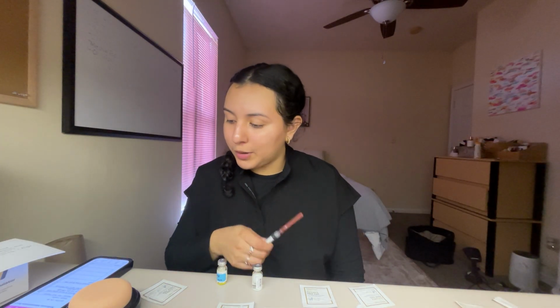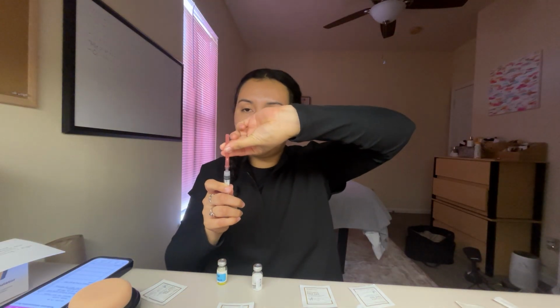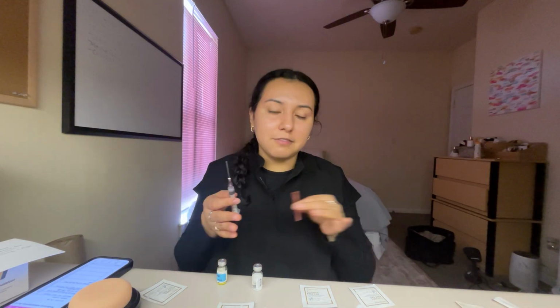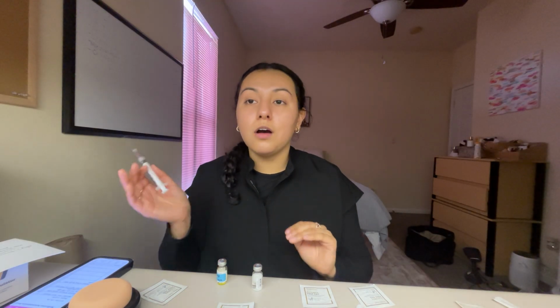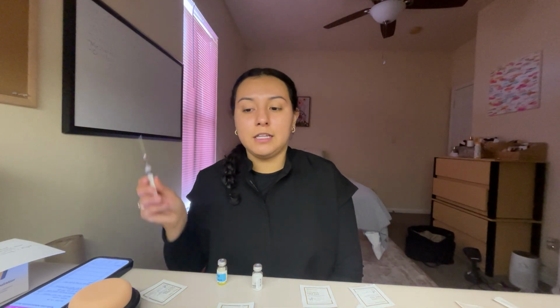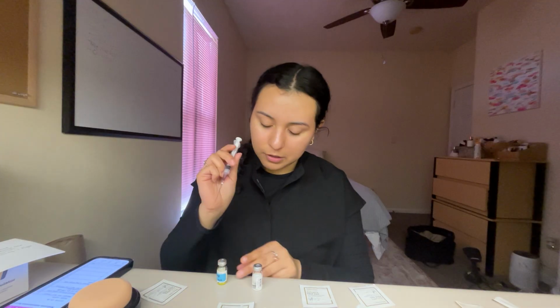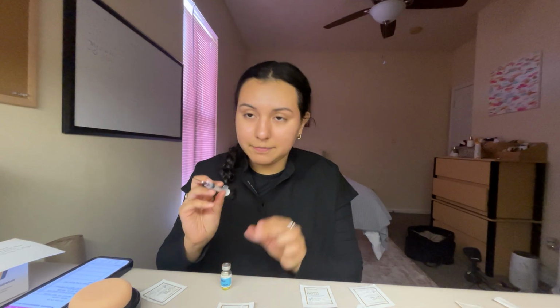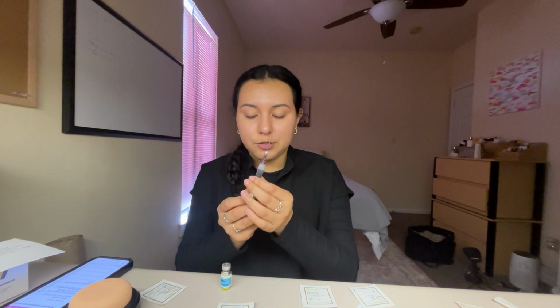And we have 0.5 milliliters. So we're going to remove our cap. And I would hypothetically have a piece of tape that I would insert this in so I wouldn't lay it down, because I would break sterility if I laid my syringes or needles down uncapped. But it says I have 0.5, so I'm going to insert it. Oh, wait, let me aspirate first. Okay, so I have half.